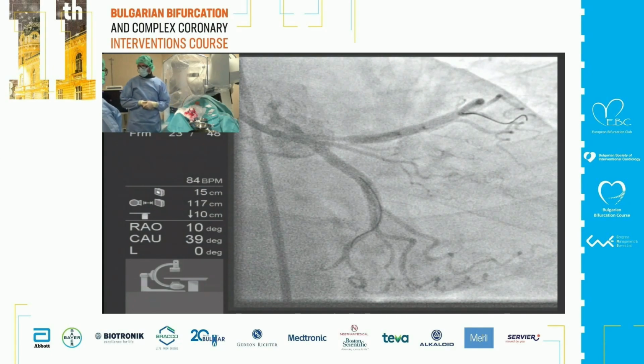Okay, operator, what is your decision? Okay, I'll take a 3.5 stent, together with IVUS. It's very nice. 3.5 by 38. So the average will be for optimization, and we'll see. Yeah, good. What is very important here is to put it at the ostium.